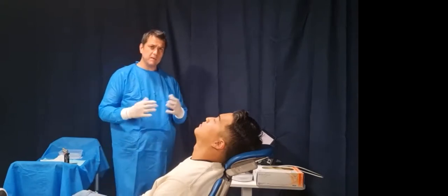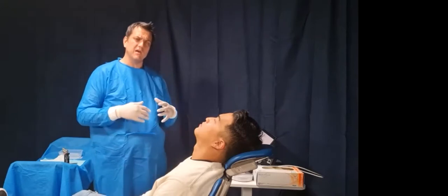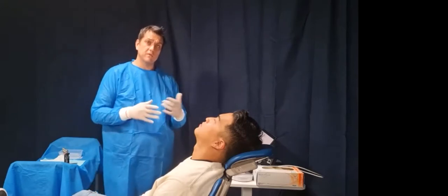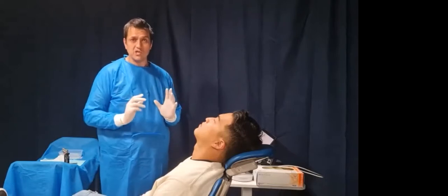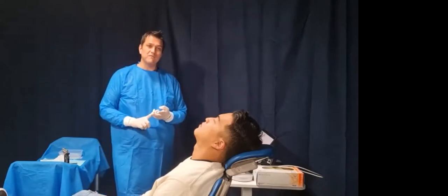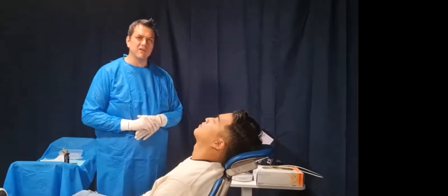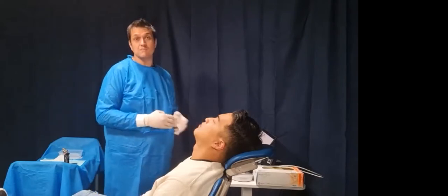Now, this process came about a couple of years ago now, when we just started getting into scanning in one of our large locations that I was working in. We had 18 chairs in that practice, and I asked all the dentists that whenever you had a splint patient, can you please put them in my book? I'll scan them up for you, I'll record their bite for you, and then you can issue the case and see how that goes. And so as part of that research project, we did about 300 cases testing this method that I'm going to show you today, and it worked very well.